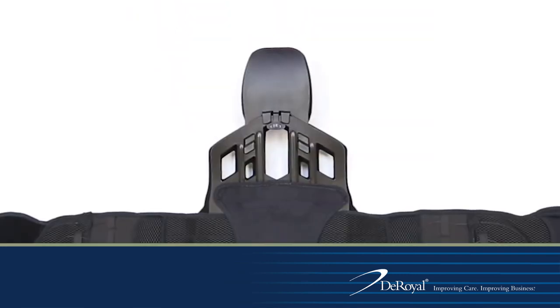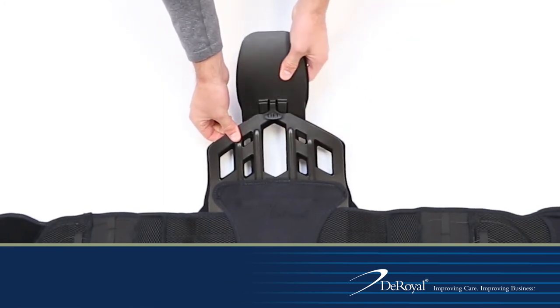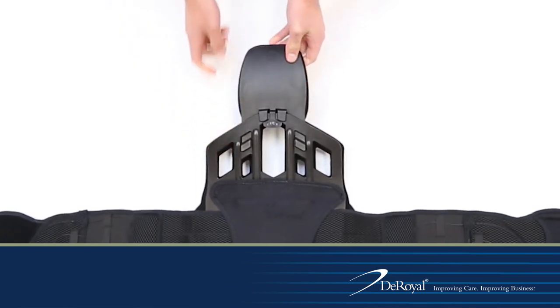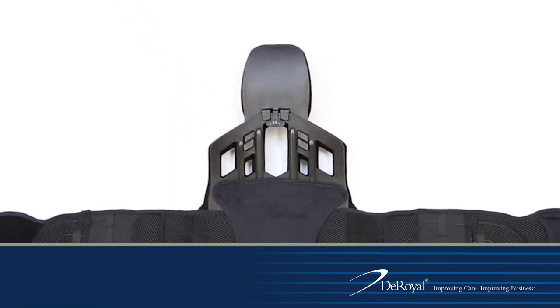To disengage the PTE, gently lift under the tab labeled 'Lift' and pull the PTE up and out. To re-engage the PTE, place the Lift tab on the outside of the posterior panel and the feet of the PTE in the anchor ports and press down to lock into place.